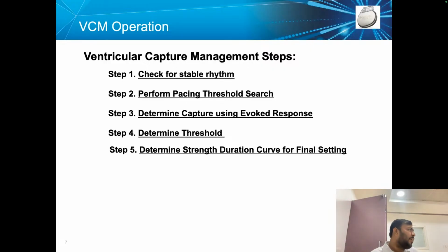There will be two different electrograms. One is for the pacing spike, and after that there is no depolarization, which according to the device means a non-captured beat. If after the pacing spike there is a negative deflection, that depolarization means it will be a captured beat. There are some disadvantages in the evoked response too, based on the implanting things. Let us see that in the future.